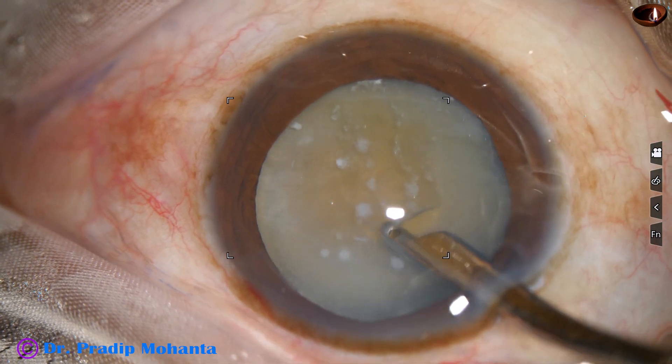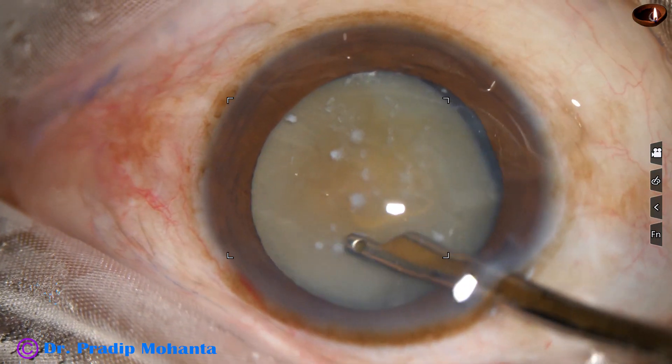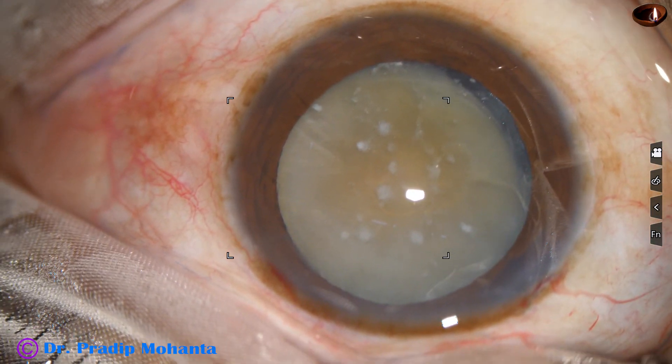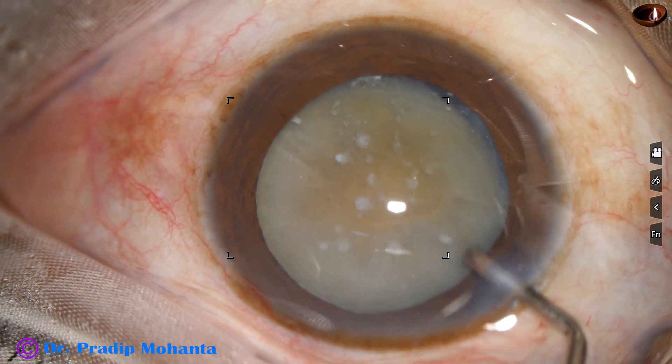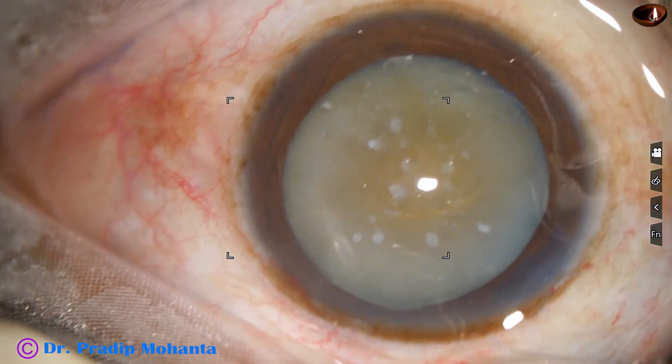In hypermature morganian cataracts, you do not have to make a mini rhexis or a small rhexis to aspirate the milky fluid. You can aspirate the milky fluid through the cleft made.